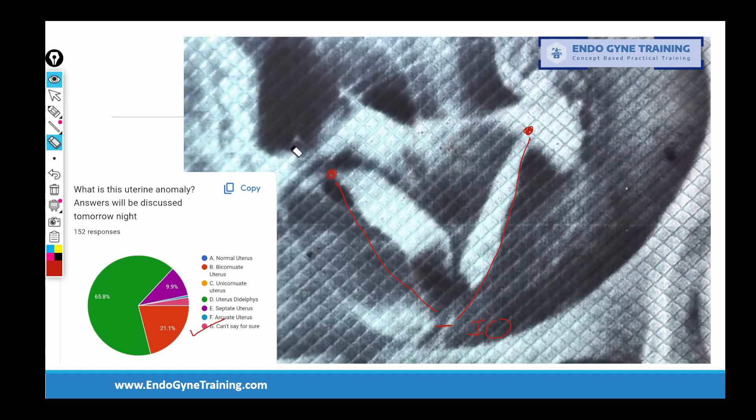The point comes to how exactly does one differentiate between these three entities of septate, bicornuate or didelphys uterus. The answer is you require a modality that tells you what is the external contour of the fundus. That external contour can be either a dipping down contour like this or a straight contour like this. In which case, this would be a septate uterus and this would be bicornuate. If the horns are completely divided all the way down with two separate cervices, maybe we could call it didelphic uterus. But it is not possible to know this on HSG.